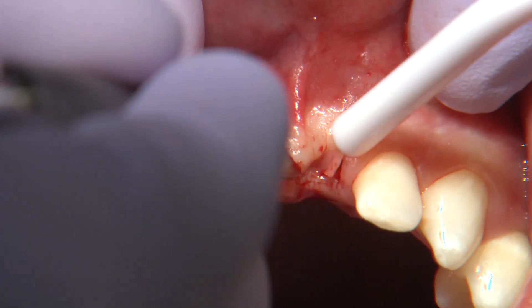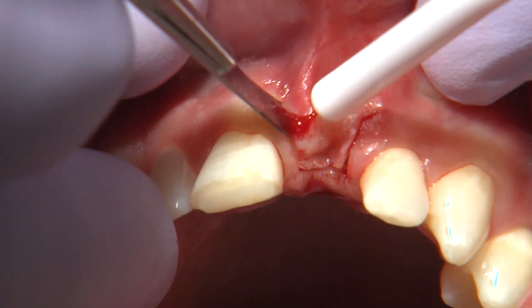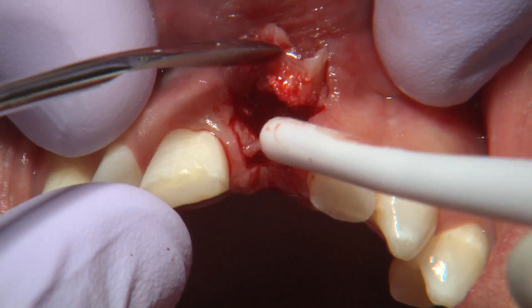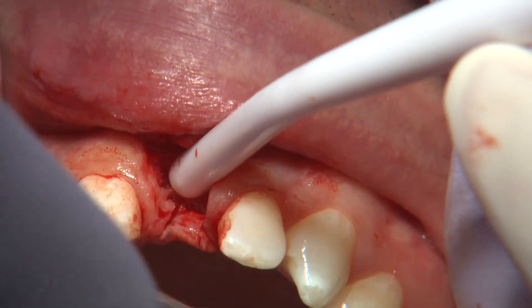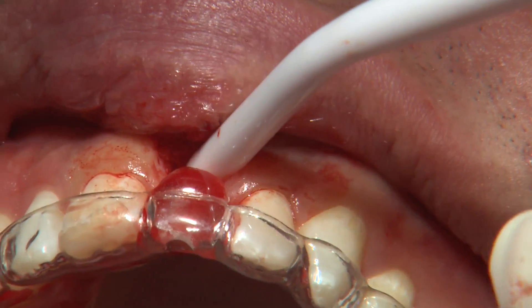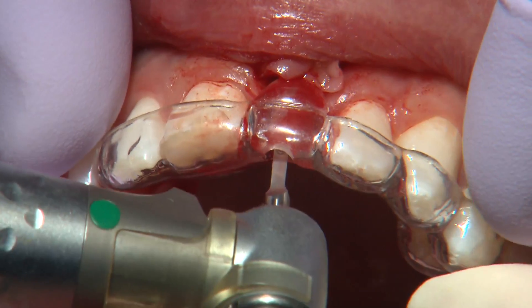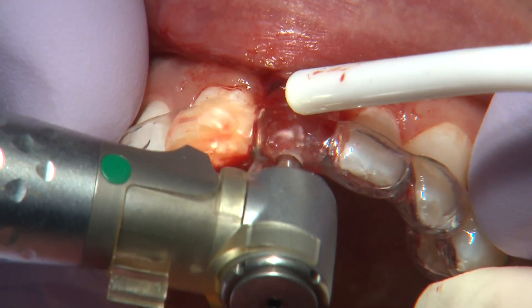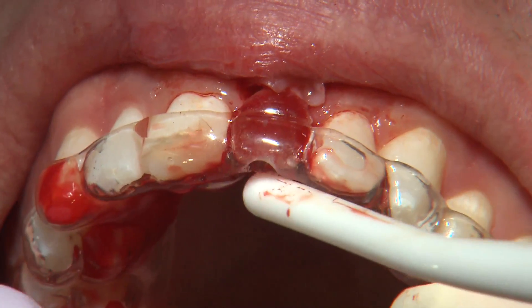During the implant placement, I wanted to create a minimal access flap to the osteotomy site. The reason for that is because I utilized the cone beam CT scan for treatment planning of this implant, so I knew exactly how much bone I had. Based on where my surgical stent is located, I know exactly where I want to place my implant, so I go ahead and create a minimally invasive papilla-preserving flap to access the bone.